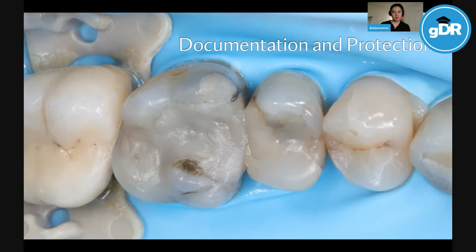Reasons why you want to take photos: documentation, protection. Have you ever done a filling on an upper premolar, like a distal, a DO, and then the patient comes back 6 months later saying, that filling you did, it's fallen out, and then it's actually the MO that's fallen out. You're trying to talk to the patient and argue with them that it was the other filling that you did. Well, if you had a photo, even if it was an intraoral photo with the intraoral camera, that would have helped protect you. So I really like taking photos for those kinds of purposes. It also helps you document your cases and show them off to the world.